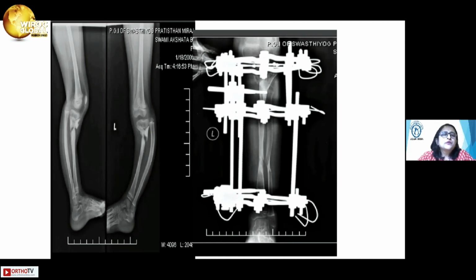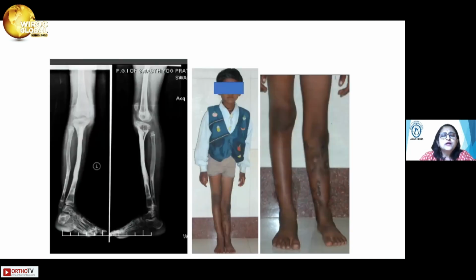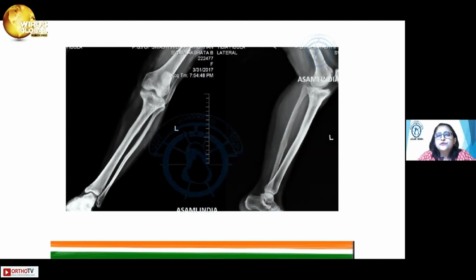So I debrided. I actually resected this sclerotic bone here and did acute docking and corrected the deformity gradually. I also ablated the remaining part of the growth plate and did a corticotomy distally and bone transport, and that's her union with complete cure of infection. As expected, she came with 4 centimeters of shortening at the age of 16 years.